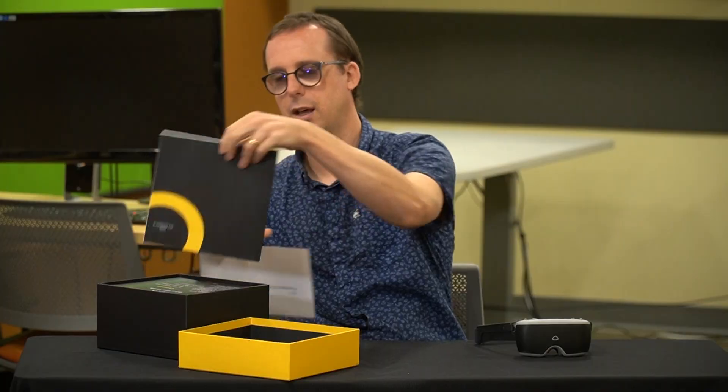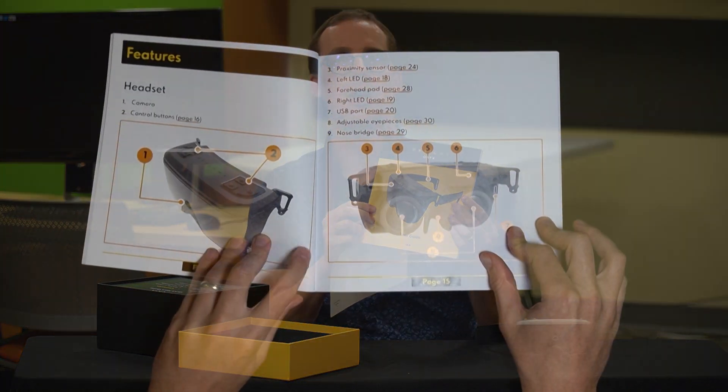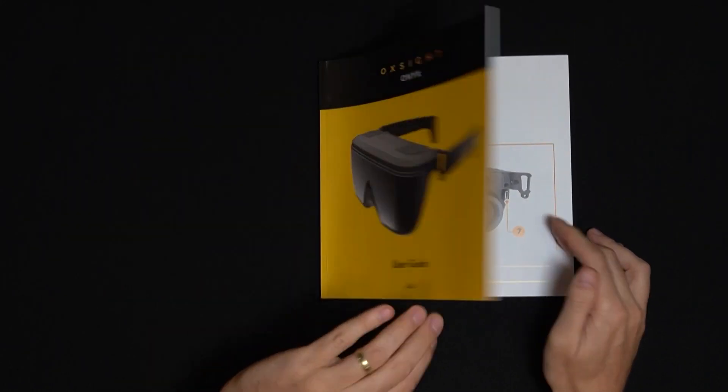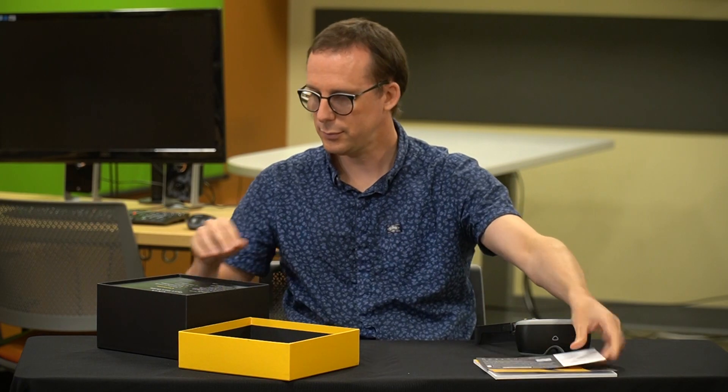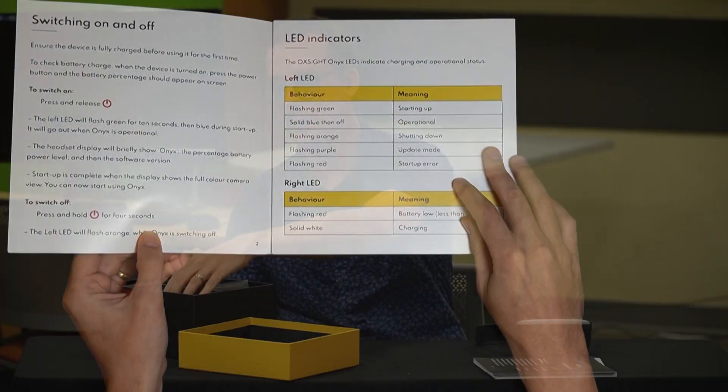First of all, we have a user guide. This is actually a pretty good guide — nice and large print, and the pictures are easy to follow. It's laminated as well, so good quality guide there. We also have a quick start guide if you just can't wait to get started with your Onix once you receive it.